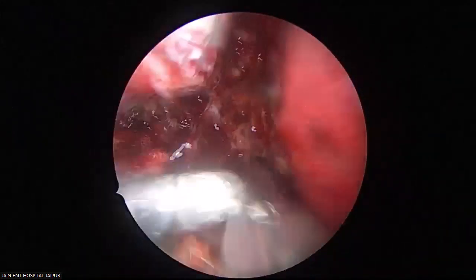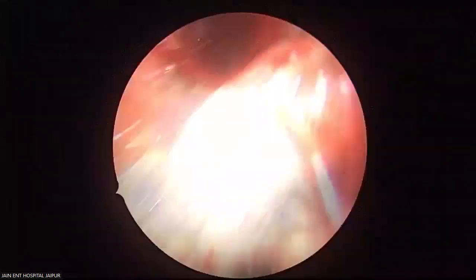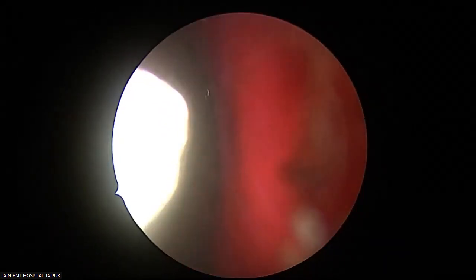Remove all packs in spite of a little bit of oozing. You suction that. Now see one by one all areas.